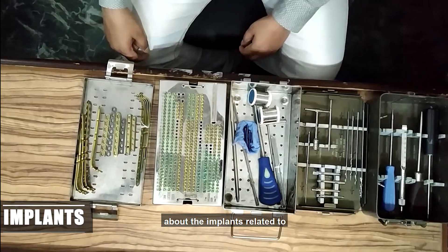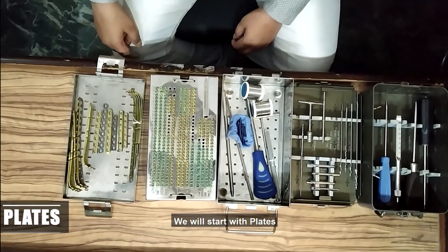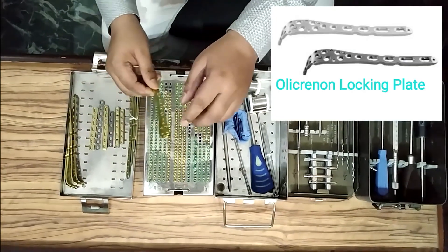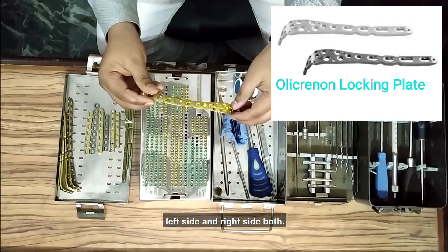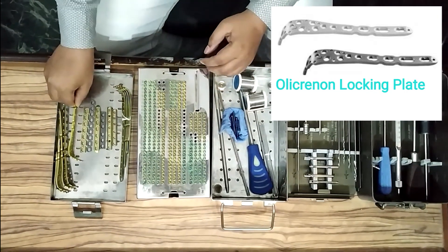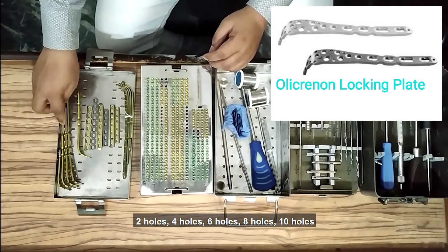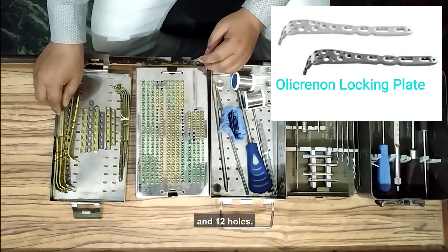Now we are going to discuss about the implants related to olecranon fracture. We will start with plates. Number one: olecranon locking plate, which comes in left side and right side both — this is a side-specific plate. It comes in two-hole, four-hole, six-hole, eight-hole, ten-hole, and twelve-hole.